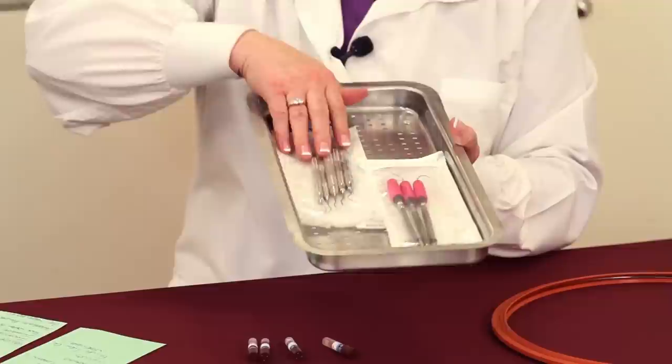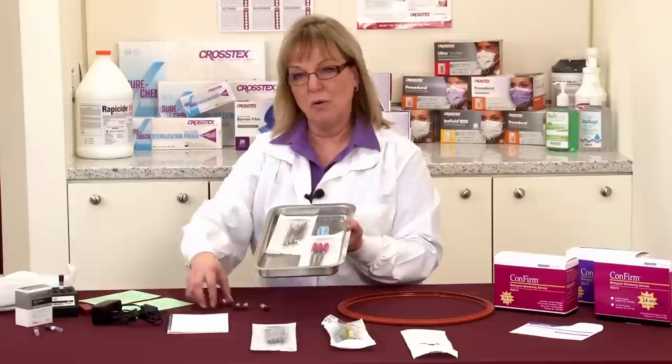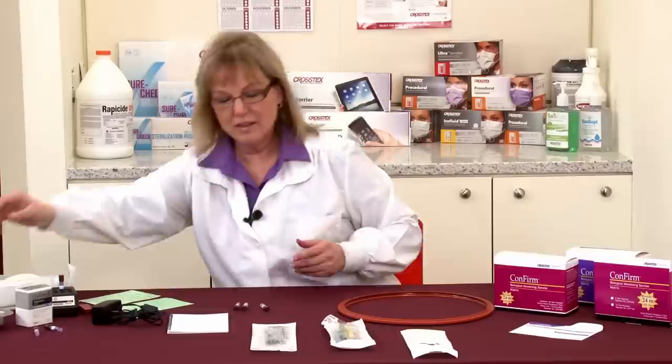What we want to do is make sure that we have our pouches or packages adequately spaced — a quarter inch between each one, not overlapping — and that we've got that spore strip or the vial either in the center over the drain or in the front by the door.